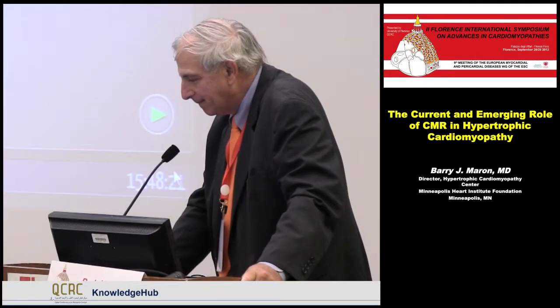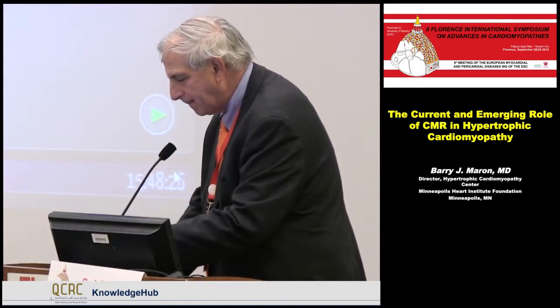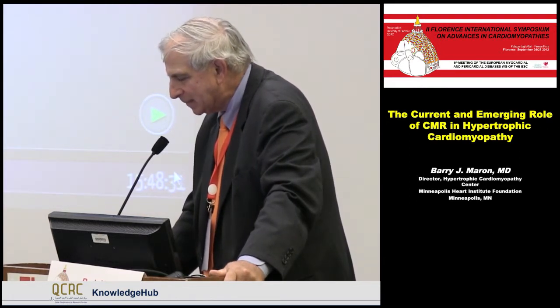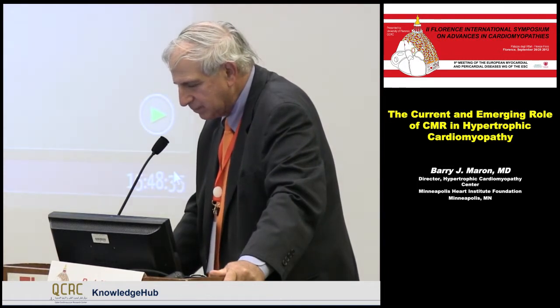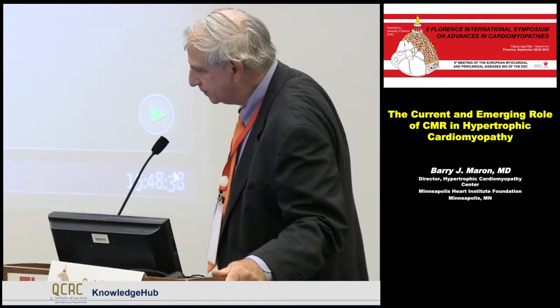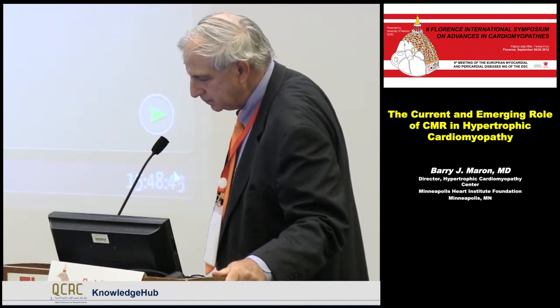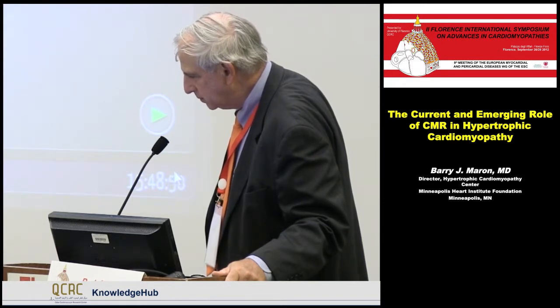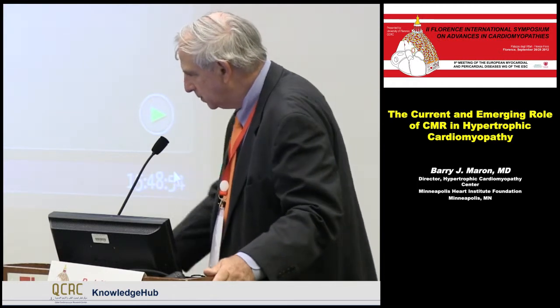We published 2 weeks ago a study in the Journal of the American College of Cardiology where we repeated 2 magnetic resonance studies in patients with HCM after a follow-up of 2 years. At the first magnetic resonance, we found a prevalence of late enhancement of approximately 80% of patients. This is a study with Italian patients. And after 2 years, the prevalence passed to 96%.